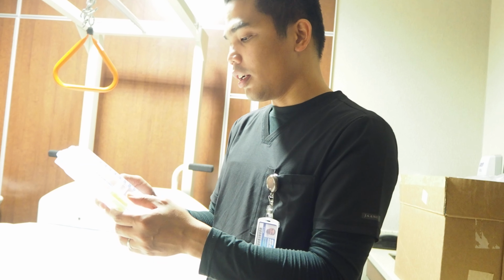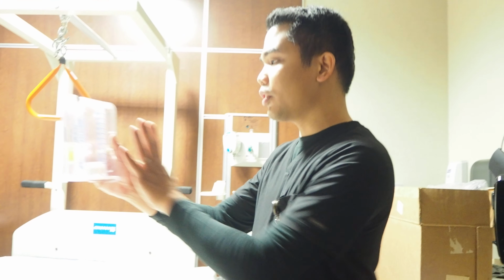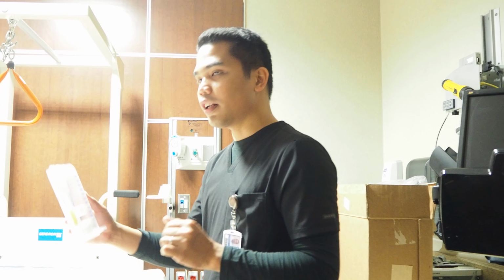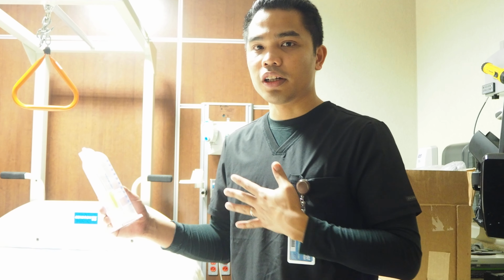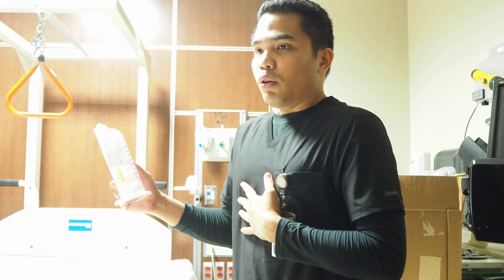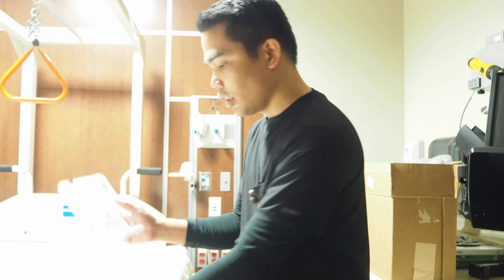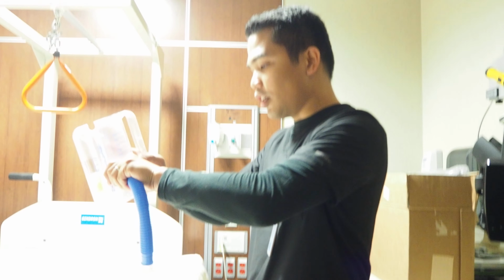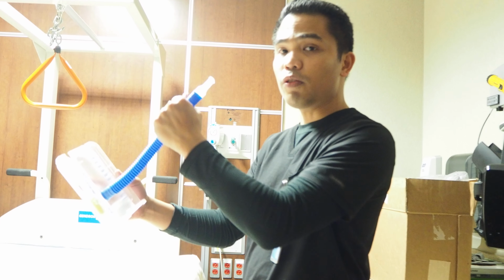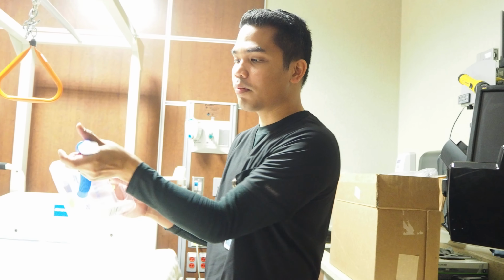if they are able to tolerate. And then when doing this, first we position this upright, and then let the patient exhale all the air out until you feel their lungs are empty. Once you feel their lungs are empty, we're going to insert the mouthpiece inside the mouth, and make sure it's sealed completely with their tongue below.